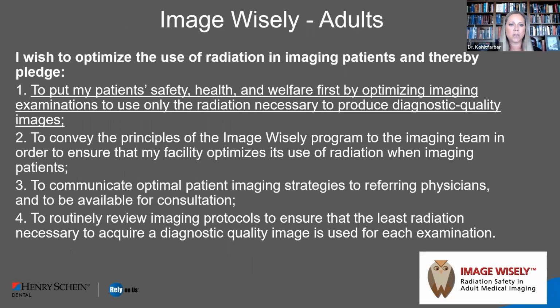Now, there is something called the Image Wisely campaign. This is a similar thing to Image Gently, but it is for adults. And basically saying the exact same thing, that we're going to be very careful with imaging. We're going to take it when needed. We're going to treat each of our patients as an individual. We're going to use any type of lead apron or thyroid collar, anything like that as needed as we can.